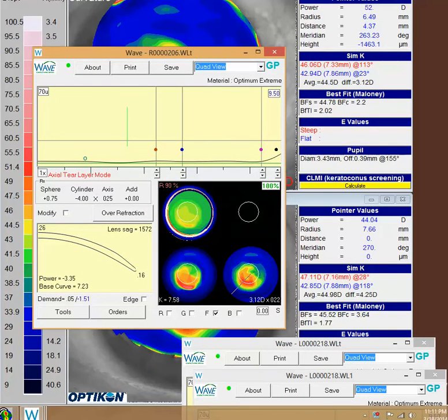And I was looking at your designs. These actually look very nice. I think going a little larger was helpful. And the one thing you may consider doing, I think you could probably get away with a larger lens because this is pretty centrally located, this cone.